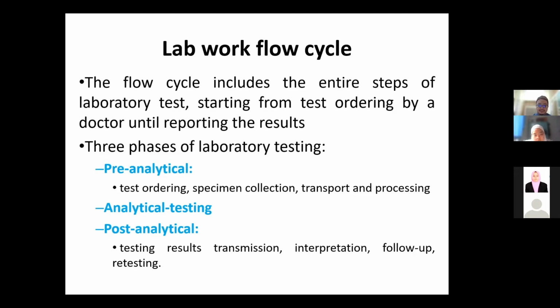And then post-analytical, yeah, which involves results transmission. How do we interpret the results? Kita run the test, sama ada dia blood smear ataupun multi-analyzer showing the full blood count, etc. How do we interpret those results?